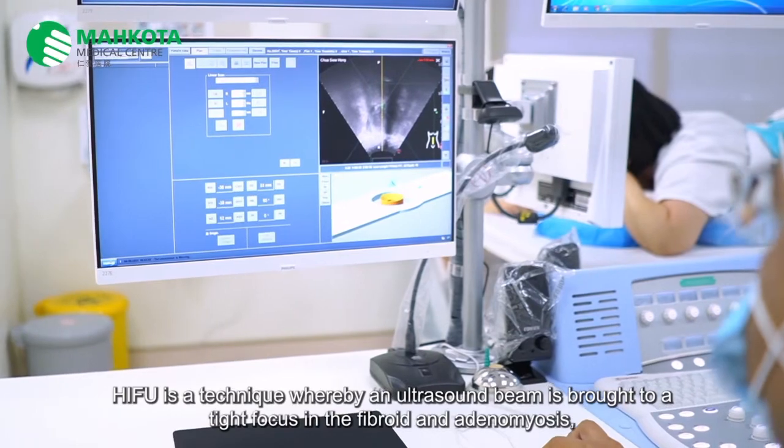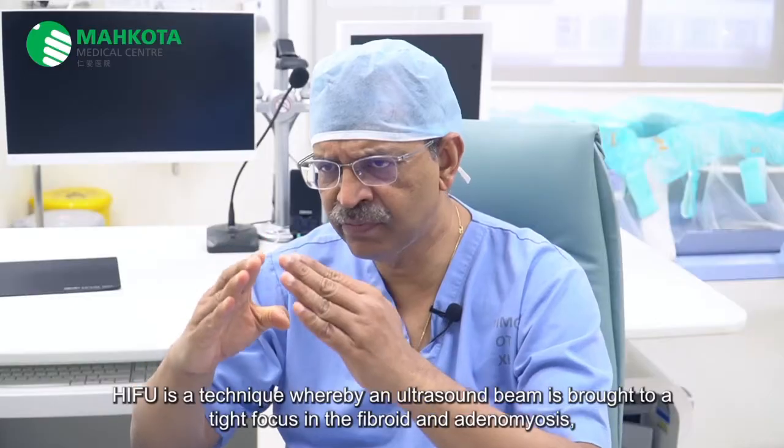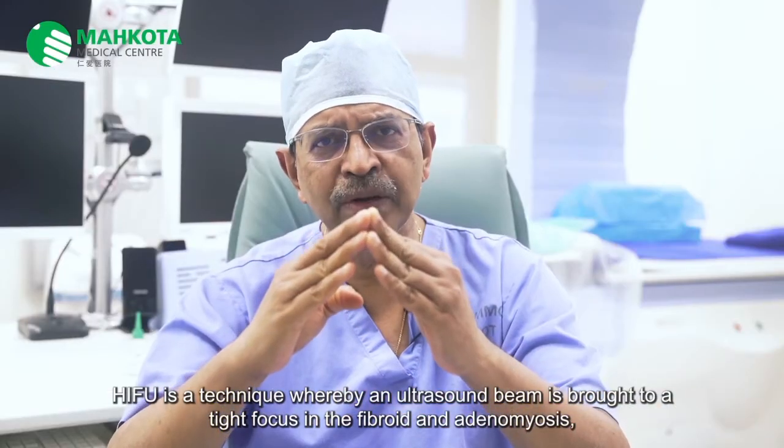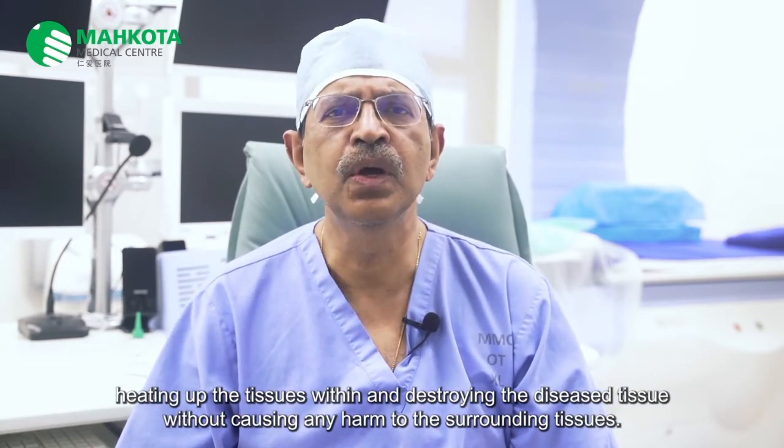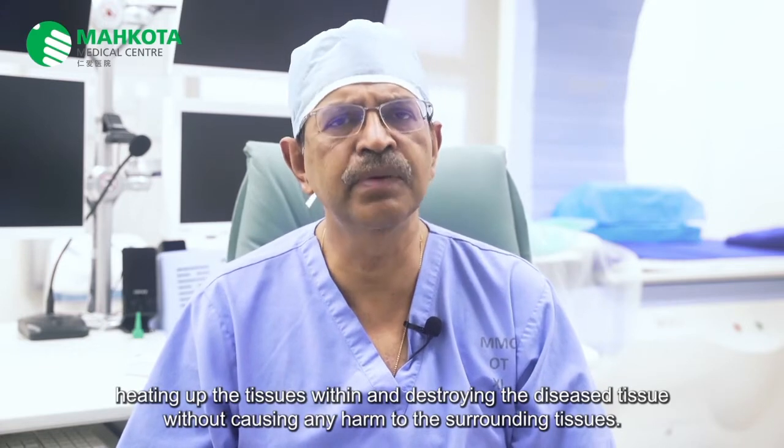HIFU is a technique whereby an ultrasound beam is brought to a tight focus in the fibroid and adenomyosis, heating up the tissue within and destroying the diseased tissue without causing any harm to the surrounding tissues.